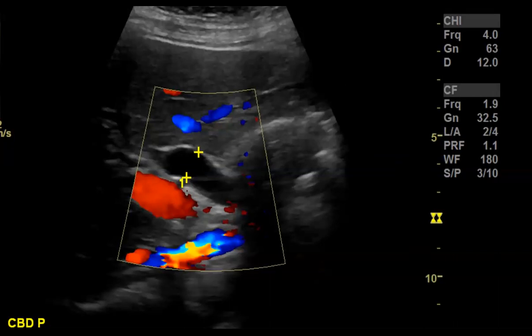So the ultrasound shows that the CBD is dilated. If that was the situation here, we would go to an MR. Yes, that's actually what we did. I think when I was putting in the ultrasound, it showed the patient name temporarily, so we might need to edit that. Yeah, that's fine. I can do it.